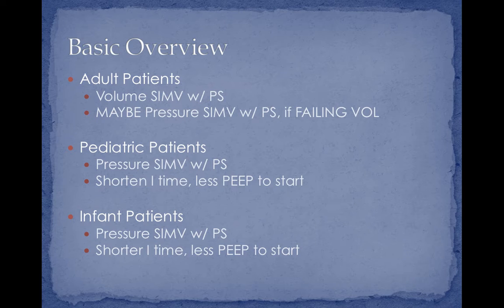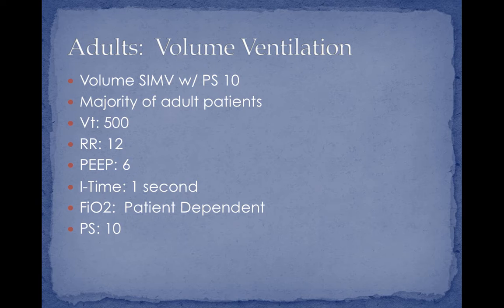Adult patients, volume SIMV with pressure support. Peds, pressure SIMV with pressure support. Infants, pressure SIMV with pressure support. These are good standards of care for critical care transport providers. We will discuss PRVC at a later time. So let's look at each of them now.